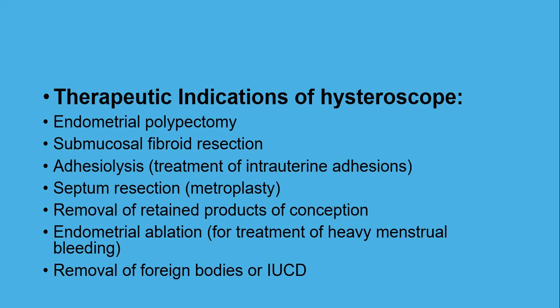Therapeutic indications of hysteroscopy. Endometrial polypectomy. Submucosal fibroid resection. Adhesiolysis, treatment of intrauterine adhesions. Septum resection, metroplasty. Removal of retained products of conception. Endometrial ablation, for treatment of heavy menstrual bleeding. Removal of foreign bodies or IUCD.